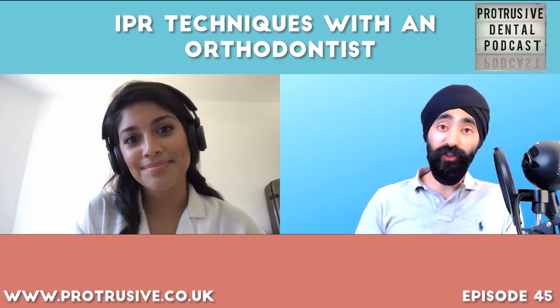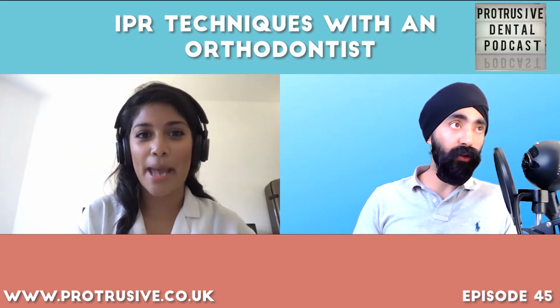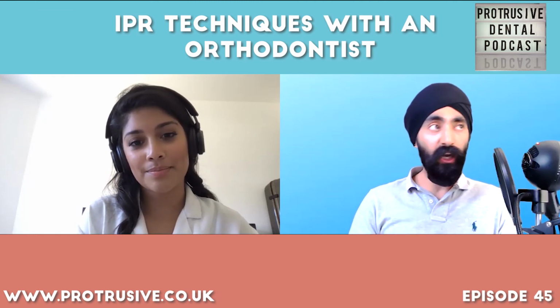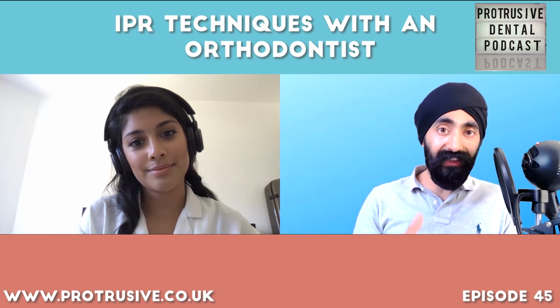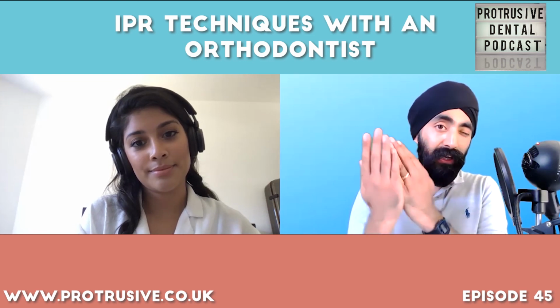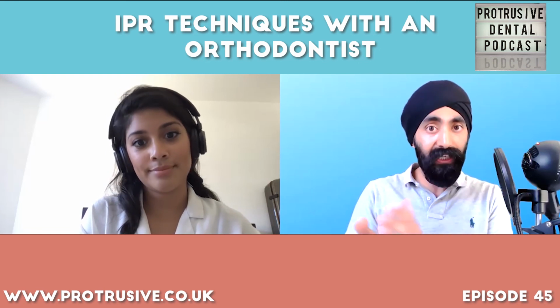Perfect. Yeah. So I think that answers it well. So we want to ideally minimize round tripping where we can, and with the beauty of ClinCheck's virtual plans, we can stage our IPR in a way that it will have to mean less IPR, even though they're not fully aligned just yet. But with the strips, I think it gives you that ability to take away a little bit per time.